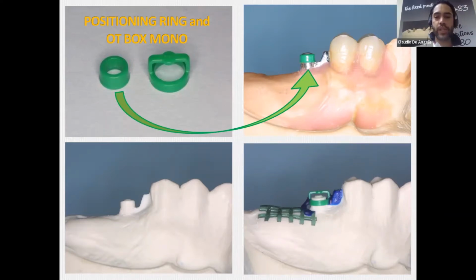You receive it with a set of castable housings, okay? You have it inside, and you place it over the sphere. We remove all the undercuts with wax, and we duplicate it so to produce an investment material model.